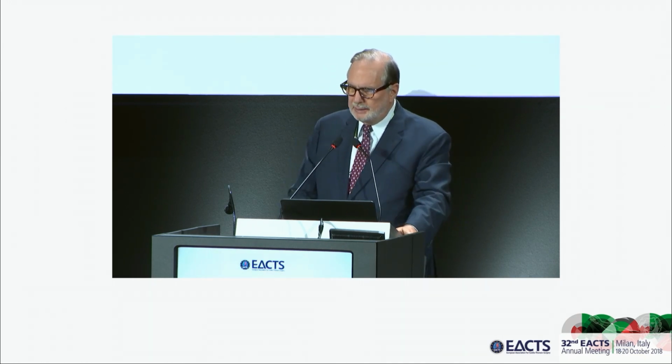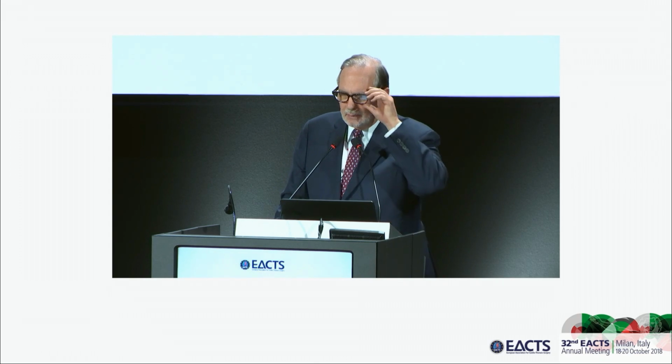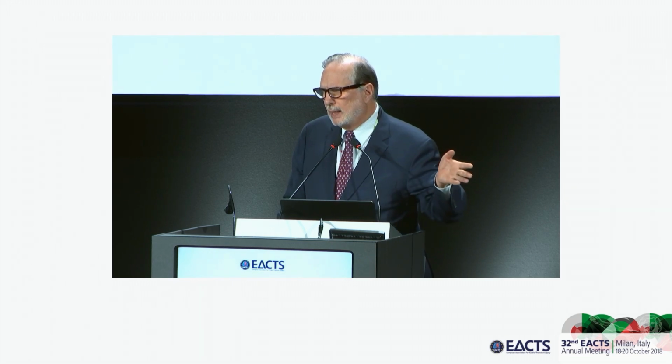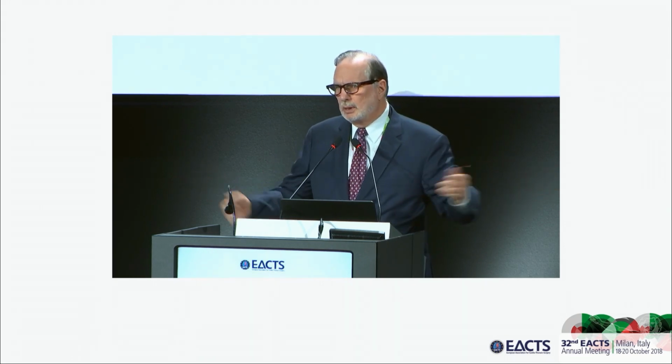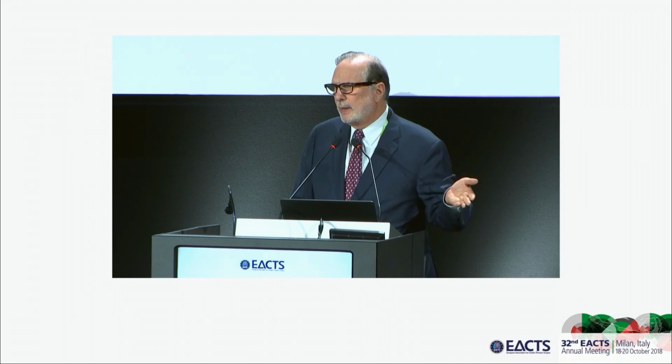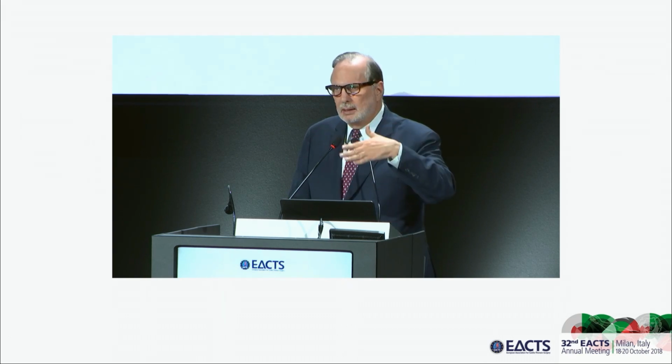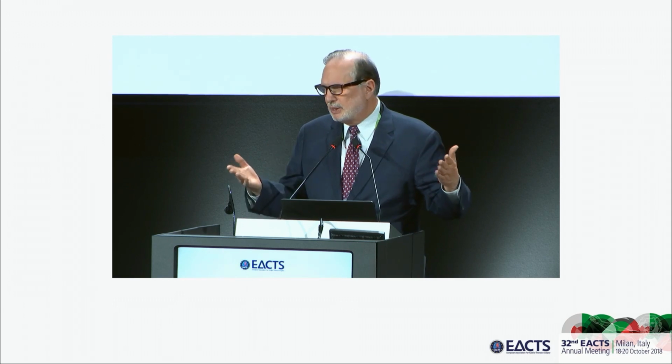What do you think? Well, that was the problem, is that I could leave it alone. The only one that might have worked regarding no residual AI, in other words, just leave the damn thing alone, was the 5th case where there was no AI to begin with. But most of these cases had +2 to +3 AI, and so we really wanted to make that 0. But I just felt like I couldn't.